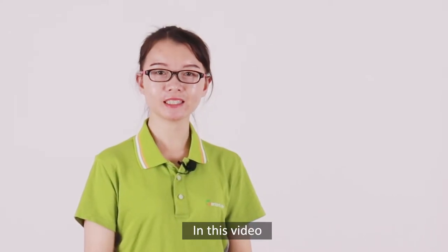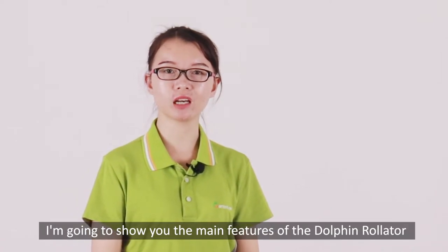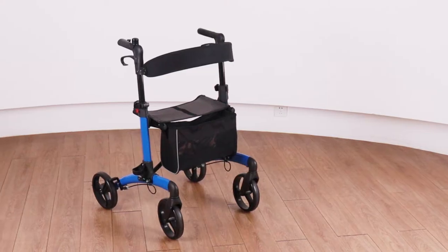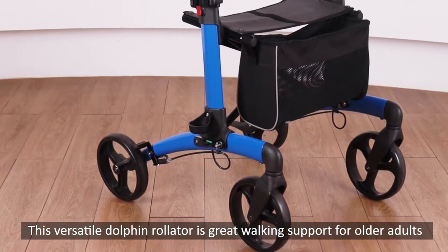Hi, I'm Emily. In this video, I'm going to show you the main features of the Dolphin Rollator. This versatile Dolphin Rollator is great working support for older adults.